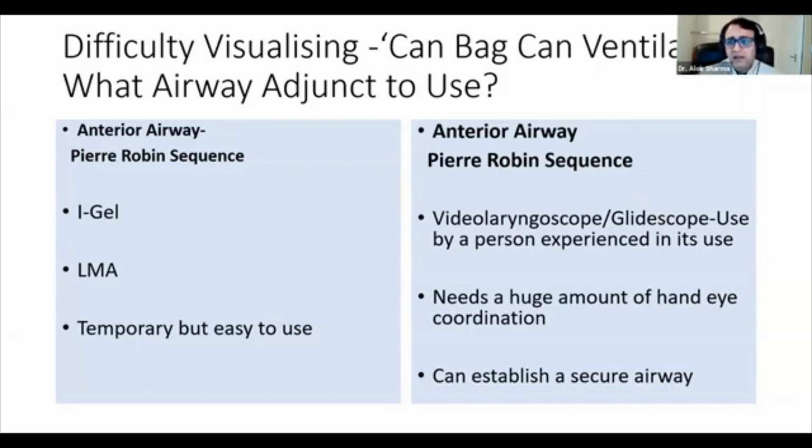And it might be that actually they can mask ventilate this baby very effectively. So put a nasogastric tube down, get a chair, sit down, relax, get somebody to make you a coffee, move that chest, make sure that you can saturate this baby, that its heart rate is coming up, get a nasogastric tube down, get somebody decompressing, because you can continue doing IPPV while help arrives.